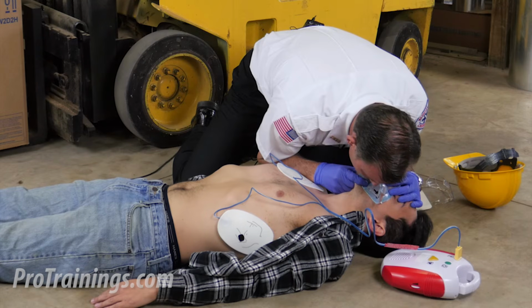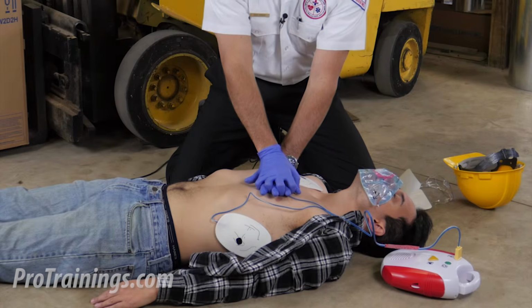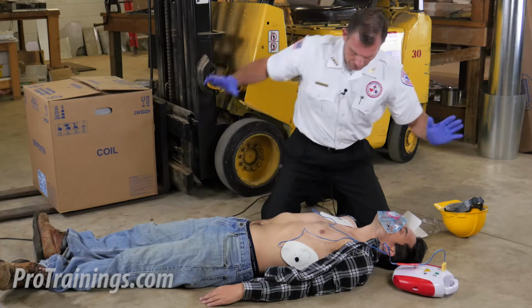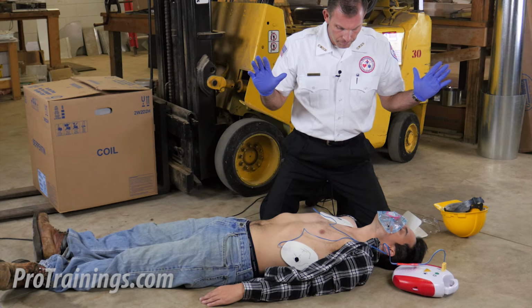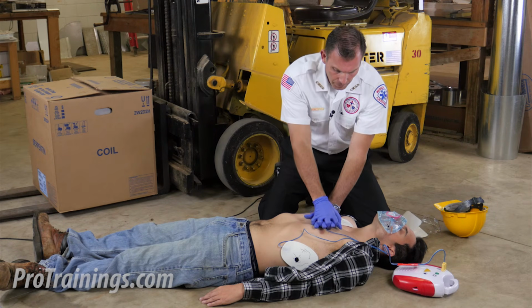A minute and 30 seconds of CPR remaining. 2 breaths go in, go right back into my 30 compressions. 15, 16, 17, 18, 19, 20, 21. Analyzing rhythm. Everyone stand clear. Stop touching the patient while it analyzes. No shock advised. Begin 5 cycles of CPR.